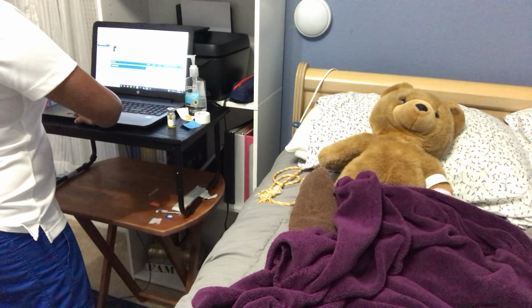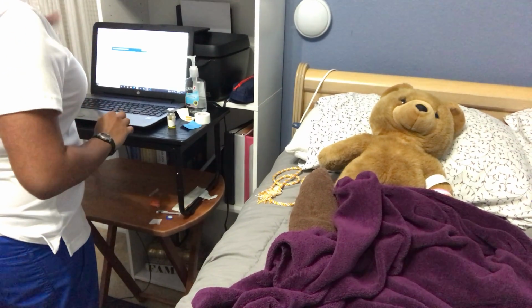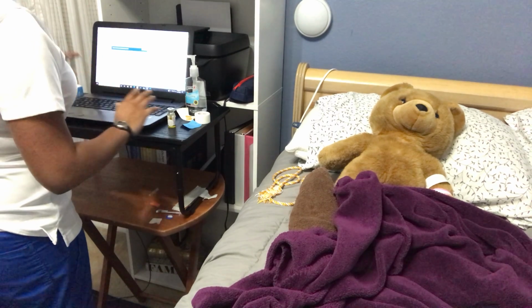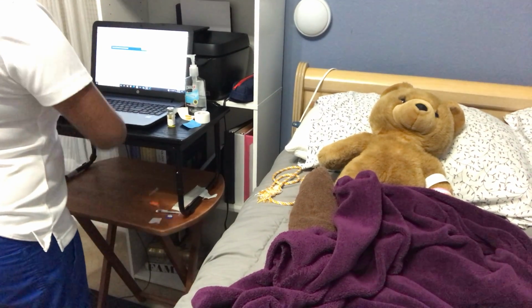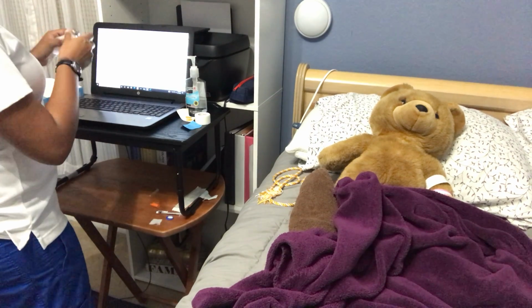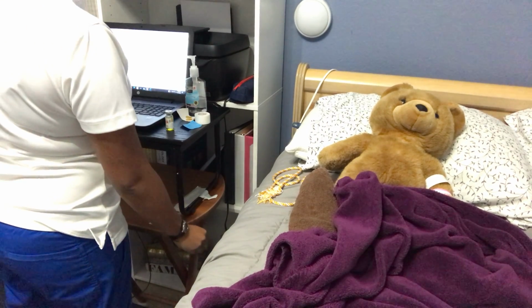So it is Oscar Simpson, the person. The medication is a medium dose insulin of Lispro, 100 units per milliliter. This was done before bed at 1900. Subcutaneous, anterior aspect of the thigh. And his blood glucose was 200 and they gave a medium dose. Okay, now I'm going to put the lot number and the manufacturer's number on here. Okay. I'm also going to put the patient's assessment.